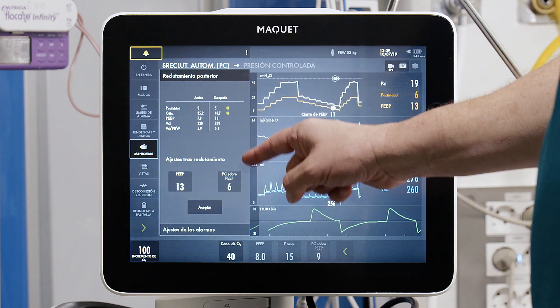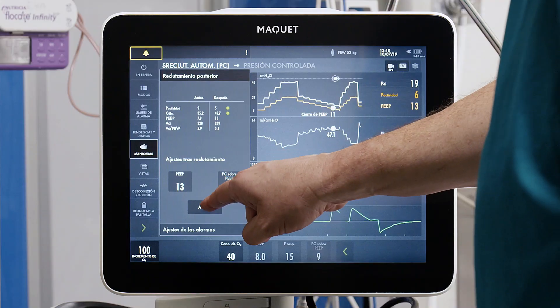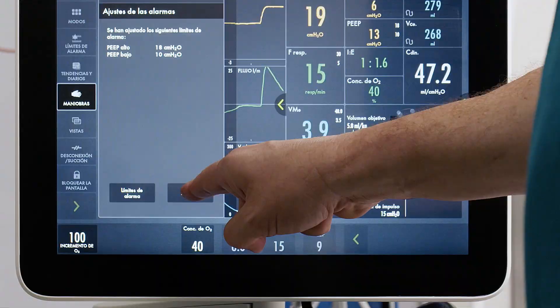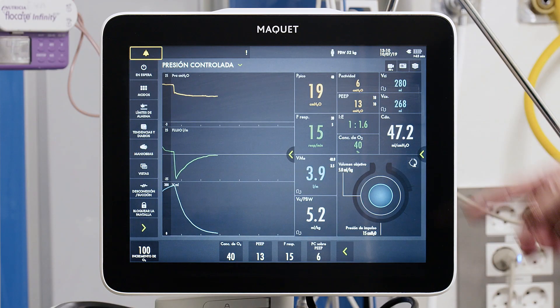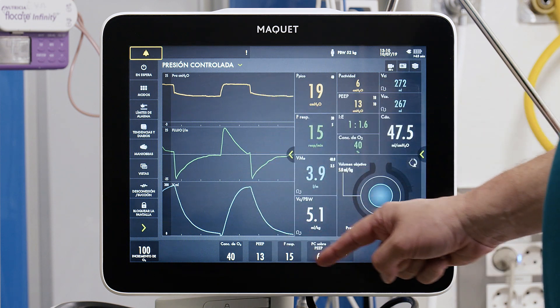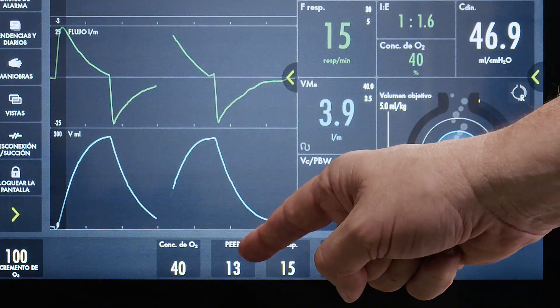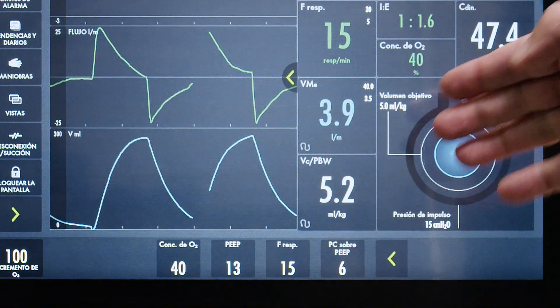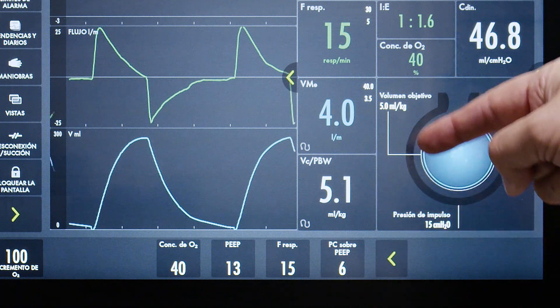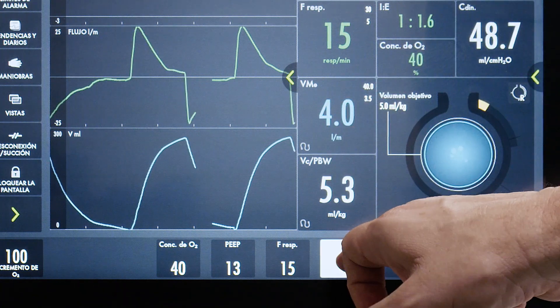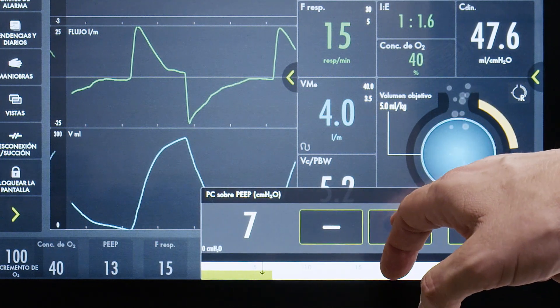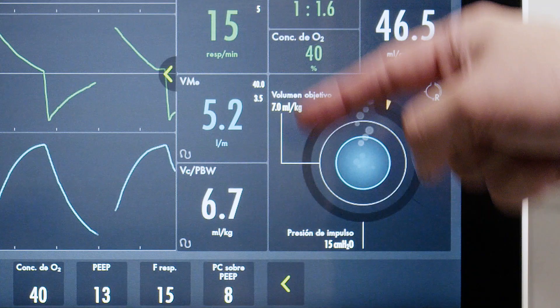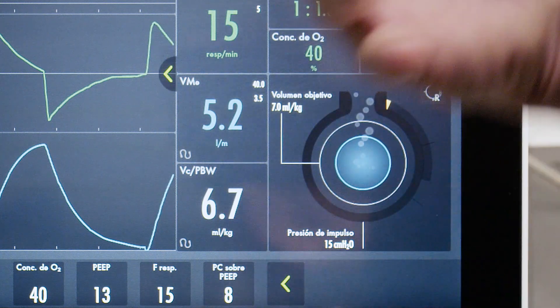The system recommendations are a PEEP of 13 and a driving pressure of 6. We accept, and the system readjusts alarm settings around the new PEEP level. We have now returned to pressure control ventilation with a PEEP of 13 as detected by the system. We need to monitor the minute volume, as a driving pressure of 6 cmH2O may be too low; we increase the pressure control level to 9 to regain a sufficient tidal volume of 6–7 mL per kilogram predicted body weight.